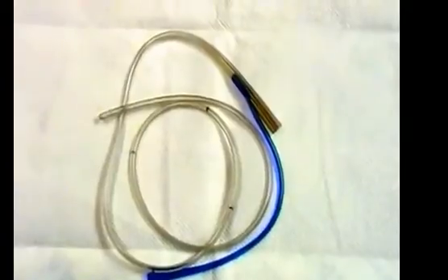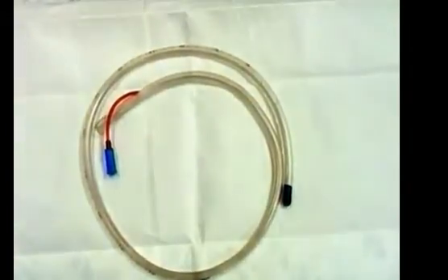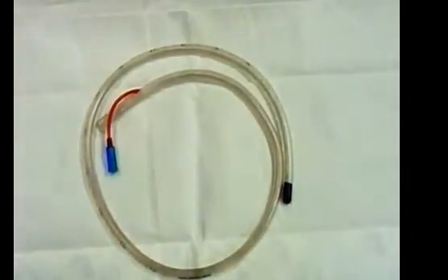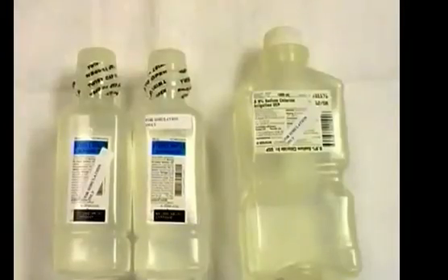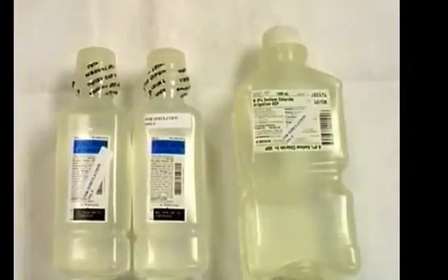An NG tube can be used with liquid ingestions but otherwise is not large enough — go big or go home. For the patient's sake, have a jelly lubricant for the OG tube. For lavaging fluid, in adults use either warm normal saline or warm water.